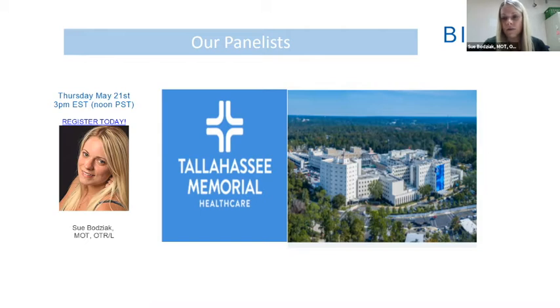And when it comes to the robotic arm, we kind of split up our time with it because we do have many patients wanting to use it, since we are neurologically based, so it's very appropriate for our clinic. So we split up the time with the robot in 30-minute sessions. And we have a sign-up for that since we have inpatients coming to use the robotic arm, but it has been a great addition to our facility.